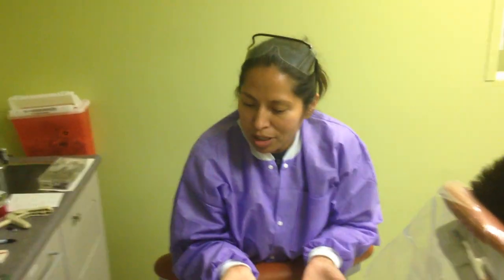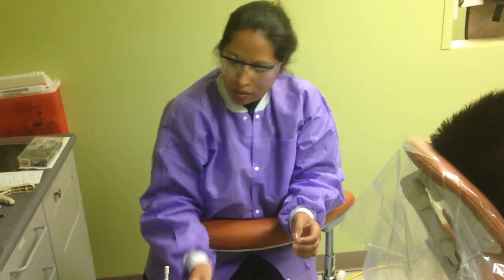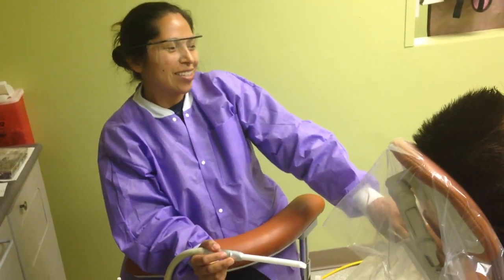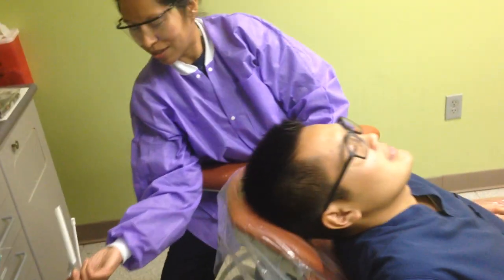When she's ready to start drilling, you have your PPE on — your goggles, your mask, your gloves, your lab coat. Kind of position yourself.